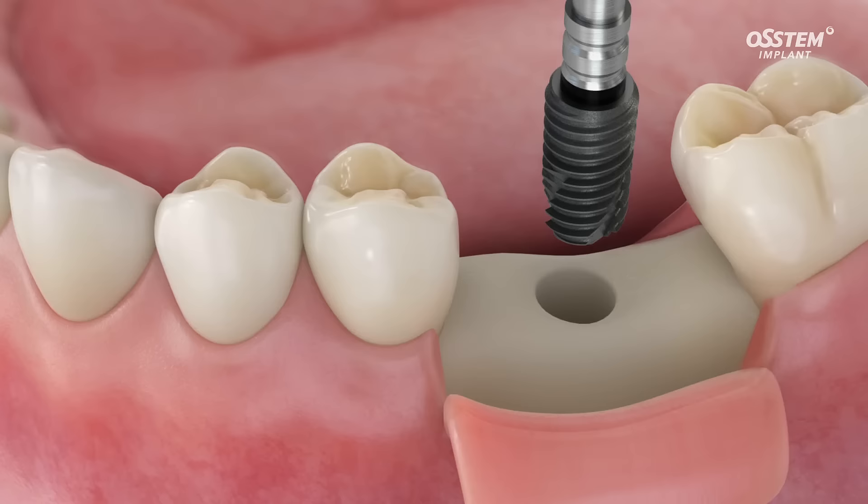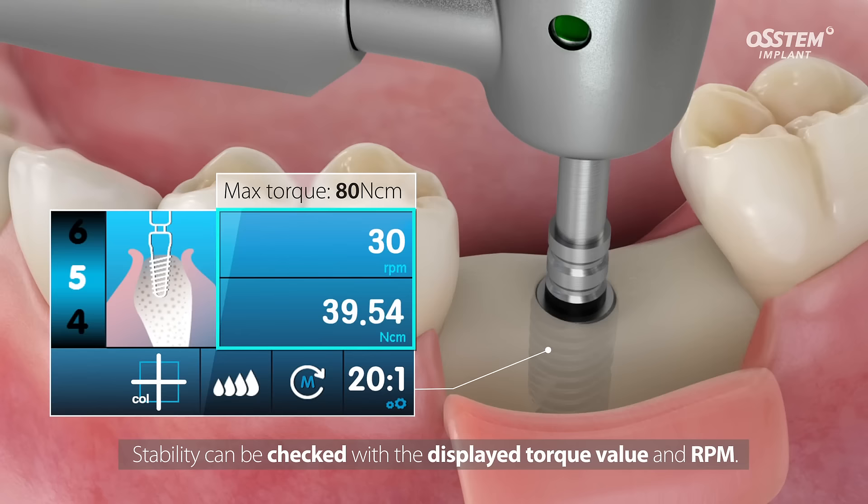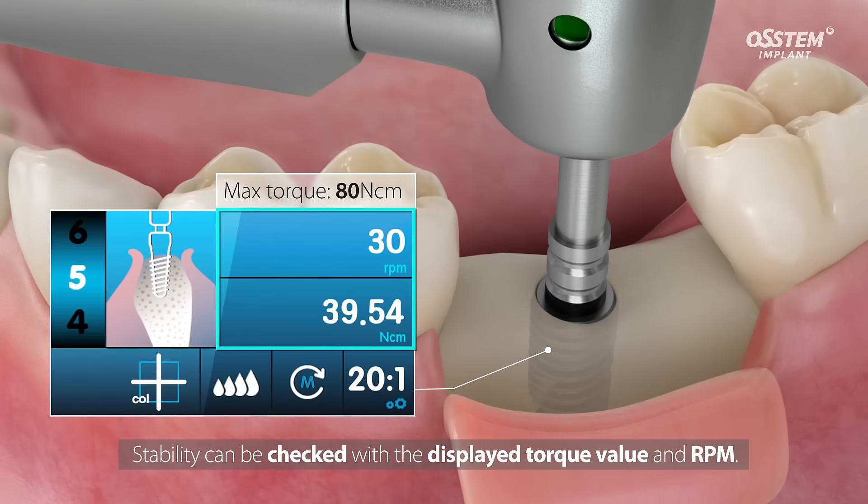Moreover, the torque value and rotation speed can be checked with ease on the LCD panel during the surgery. Try the SM5, the surgery engine that has outstanding chucking force and that displays the torque value and rotation speed during surgery.